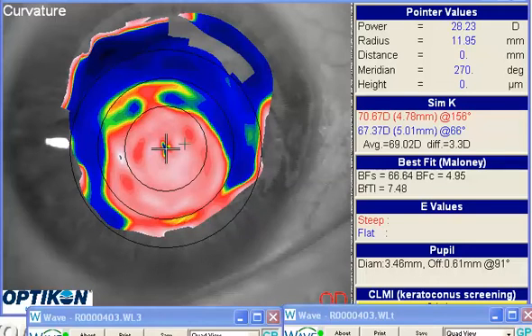And if we think about this, remember this is kind of that mountain peak. You've got the lens landing zone out here, you got the mountain peak up here, so you got this big area to traverse, and through here that cornea drops off quite a bit, so you got this kind of gap between the lenses that is probably going to fill up with fluorescein and tend to collect some air bubbles down there also. So with that said, how can we get this lens to fit a little bit more cleanly?